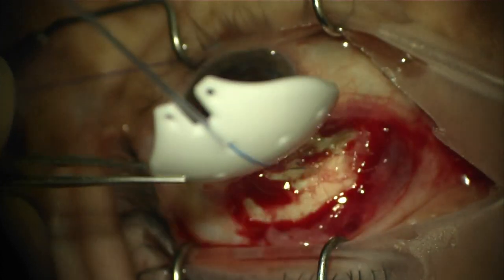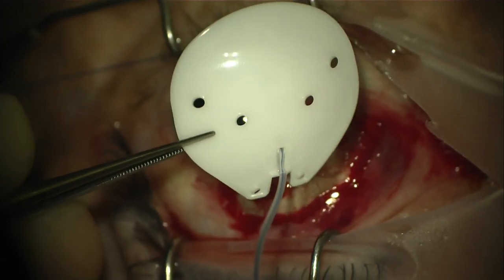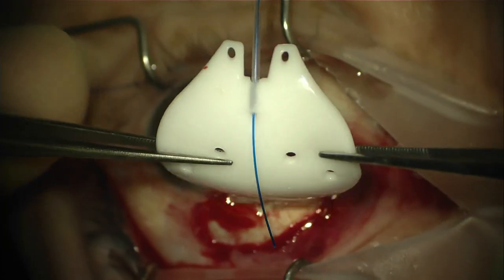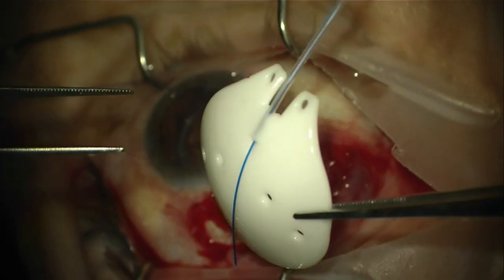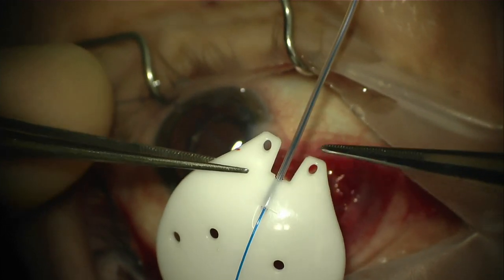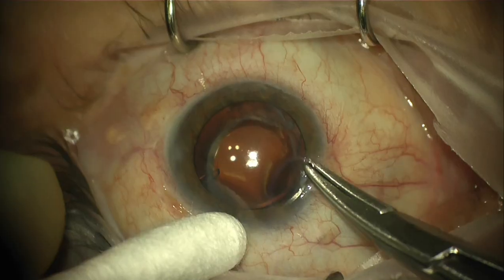Both models come packaged with a pre-placed ripcord suture which can be removed depending on surgeon preference. A couple of nice features of the device are the flexibility of the plate and its curvature, which really seems to follow the contour of the globe to facilitate implantation. Perhaps the most useful improvement is the anterior placement of the fixation holes, which really facilitate fixation of the device.